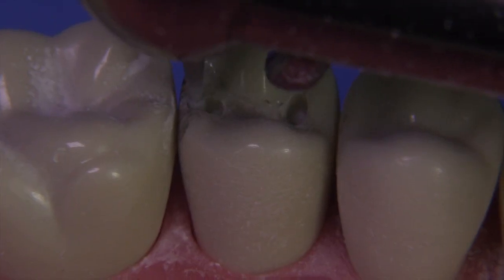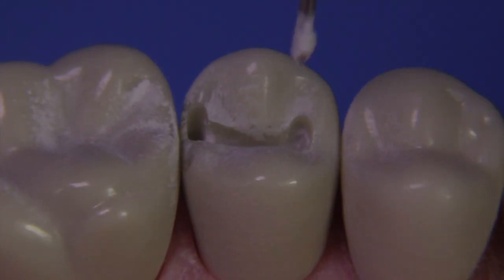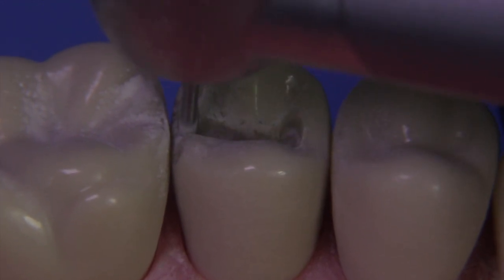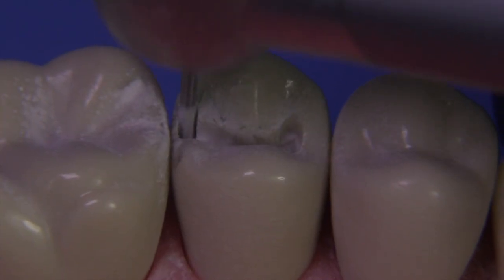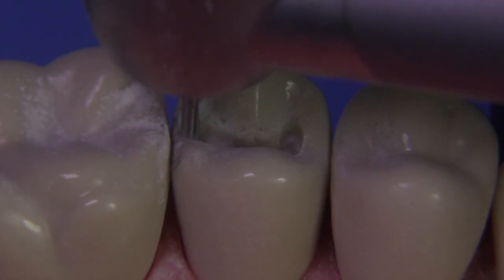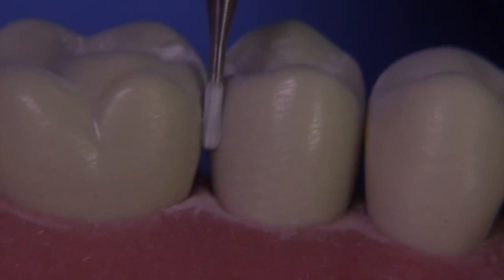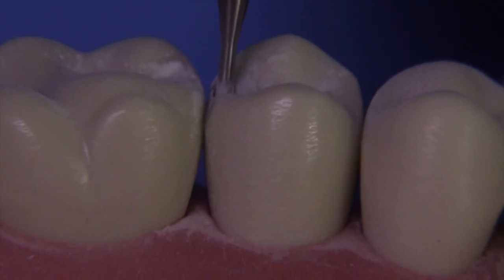Move the burr as far as you can comfortably to get to that distal area, but don't break through and hit the adjacent tooth. At this point, let's switch over to the 245 carbide and just make a little slit, moving the burr down gingivally as we're trying to break the gingival contact. How far do we go? That's the length of the burr — three millimeters — and we're going to have to get at least that far, a little bit further, in order to break the contact.